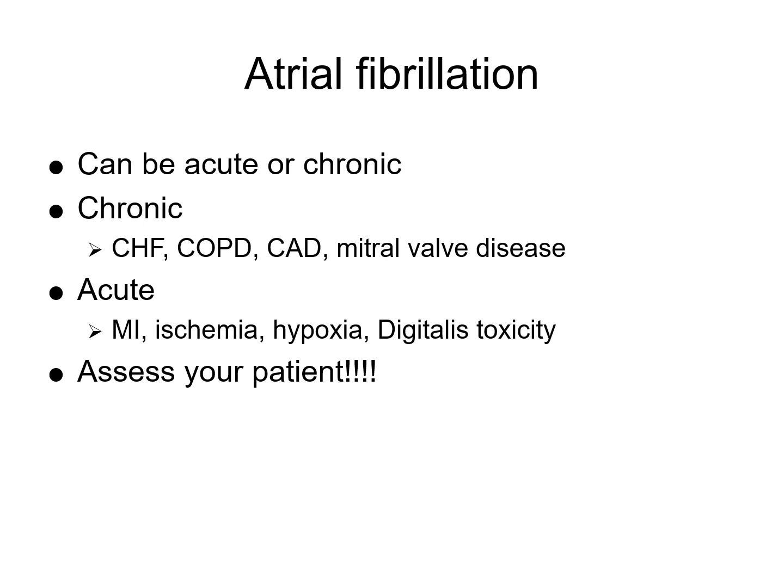Acutely, we need to look to see if they're having an MI, if there's some ischemia, if there's hypoxia, digitalis toxicity. So you can always assess your patient, checking their blood pressure.